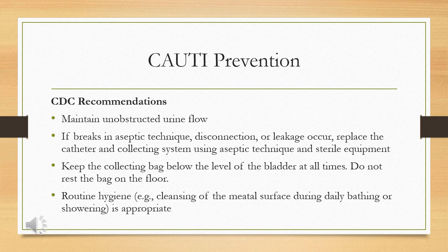Cleansing the meatal surface during daily bathing or showering is appropriate. So there should be some routine hygiene going on when bathing the patient to prevent CAUTI.